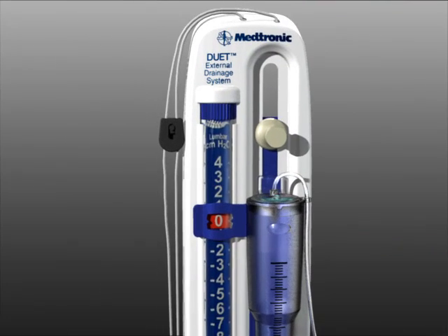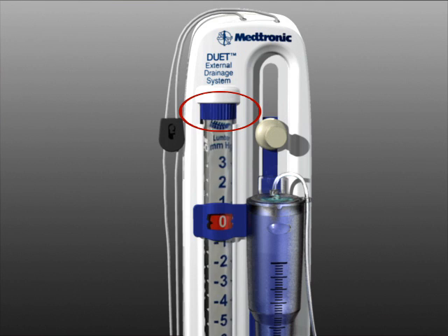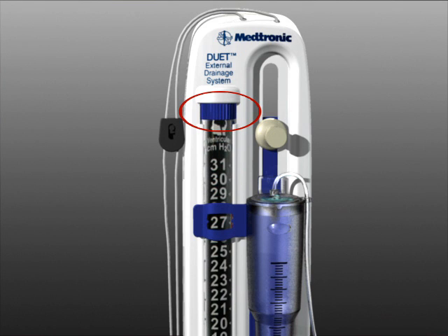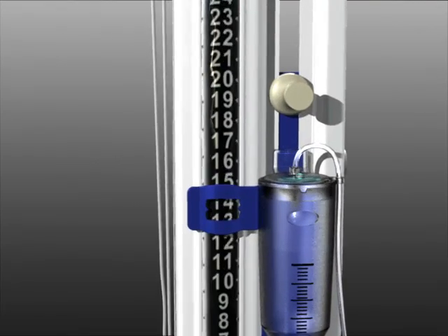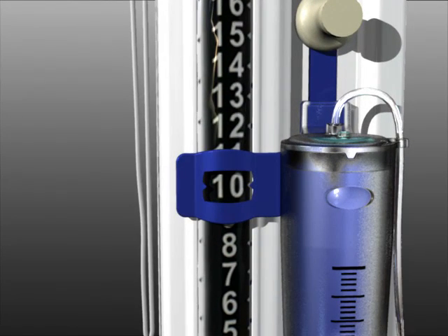Using the blue knob at the top of the pressure scale, rotate the scale to the desired position. Raise or lower the drip chamber to the desired pressure level as indicated by the physician.